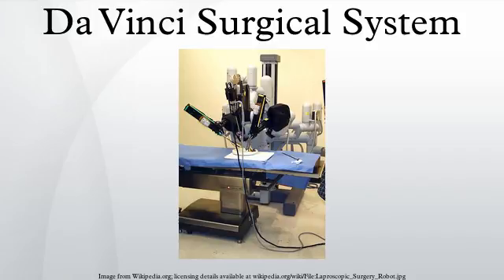Overview. The Da Vinci system consists of a surgeon's console that is typically in the same room as the patient, and a patient-side cart with 4 interactive robotic arms controlled from the console. 3 of the arms are for tools that hold objects, and can also act as scalpels, scissors, bovies, or unipolar or bipolar cautery. The surgeon uses the console's master controls to maneuver the patient-side cart's 3 or 4 robotic arms.